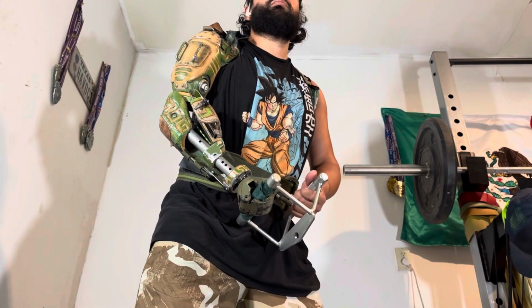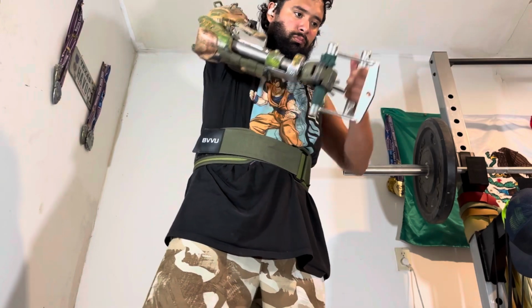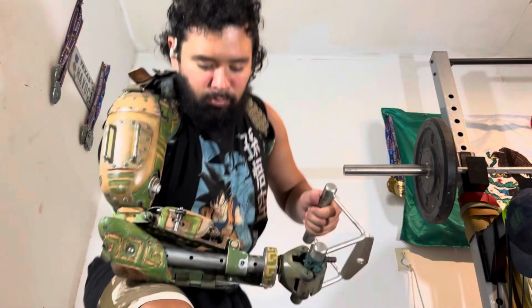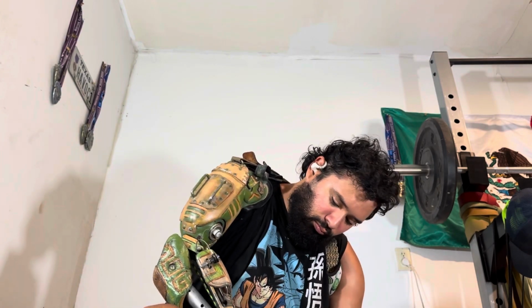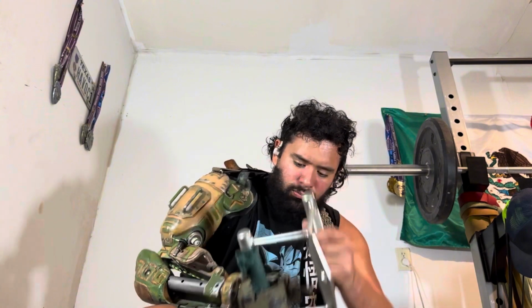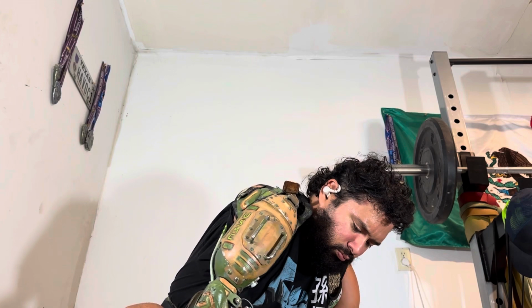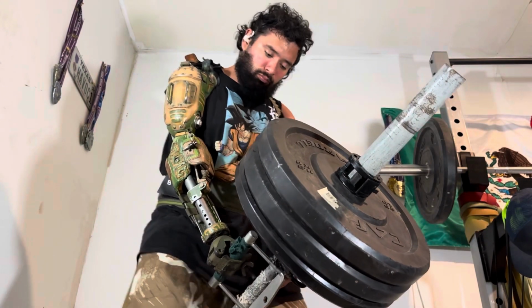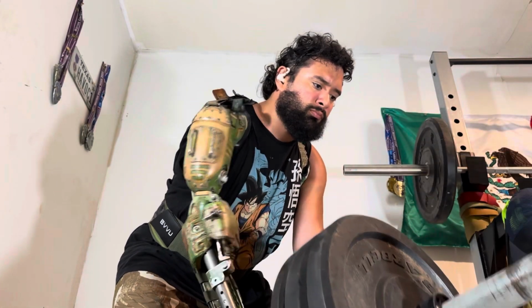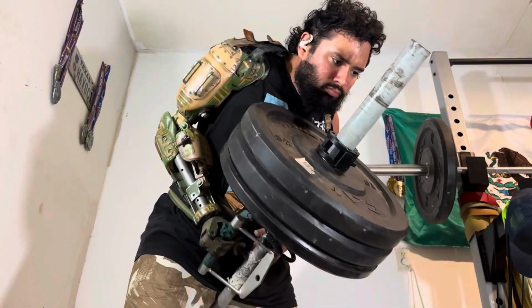So I wanted to take y'all through a little workout with the Havoc arm, and I would consider this a back workout, even though it's lats, lat pulls. And a lot of people have questioned what I'm working whenever I'm doing pulls, and it's a little confusing because after I work out my arm, I definitely feel it after lat pulls, specifically in my shoulder. But that's because I have such a high amputation level, so it's really hard to isolate specifically my lats, even though I would consider this a lat heavy workout.